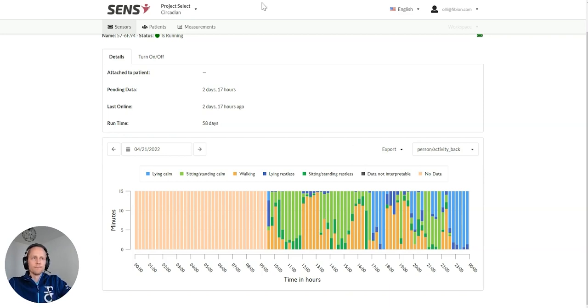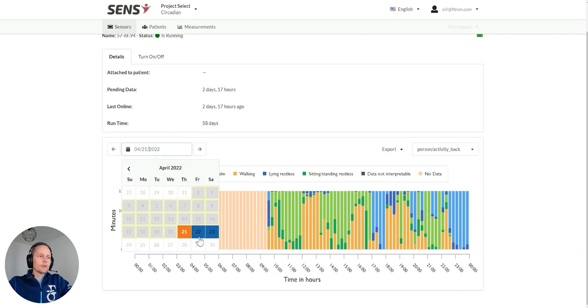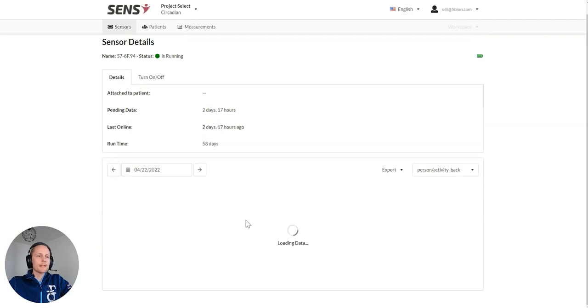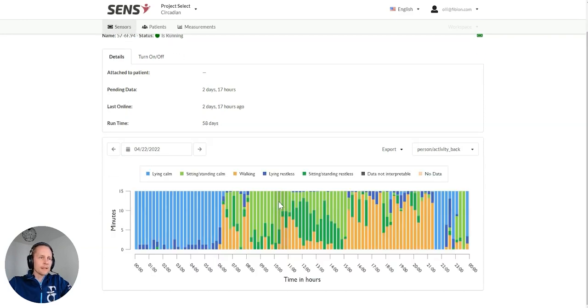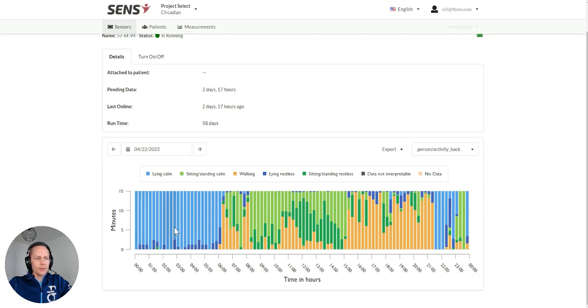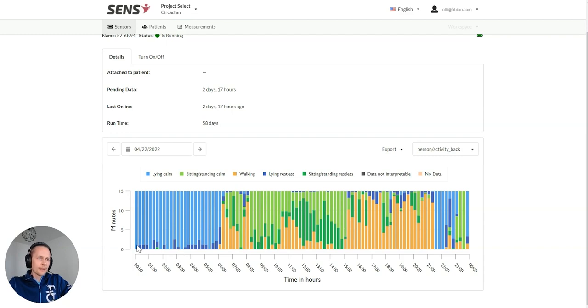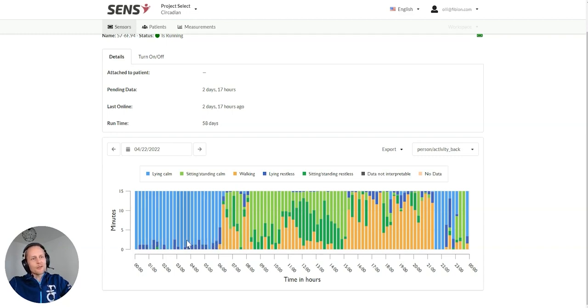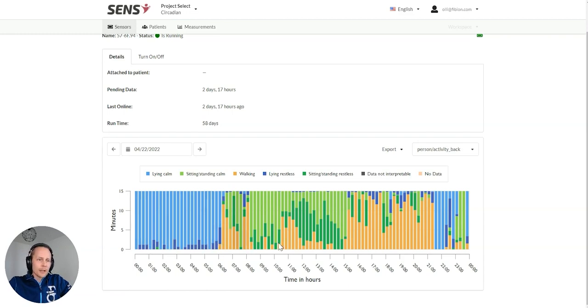Sometimes it might be data that doesn't fit any of these and then it would be shown in gray color. Then I can also go to the next day and I can see the data. How has it been? The person has been sleeping and waking up a little bit after 6. The sleep has been pretty calm, pretty restful.